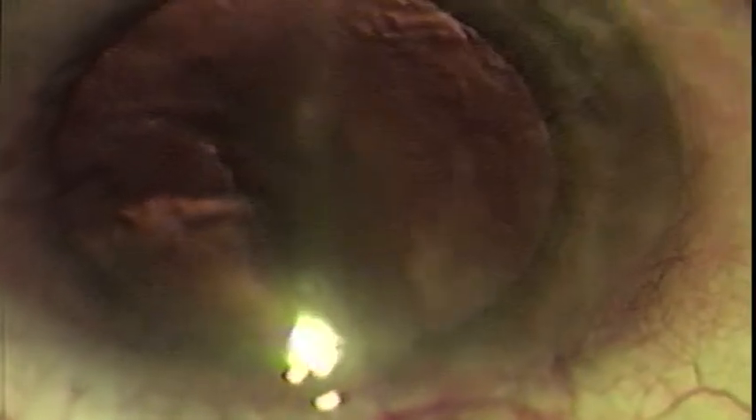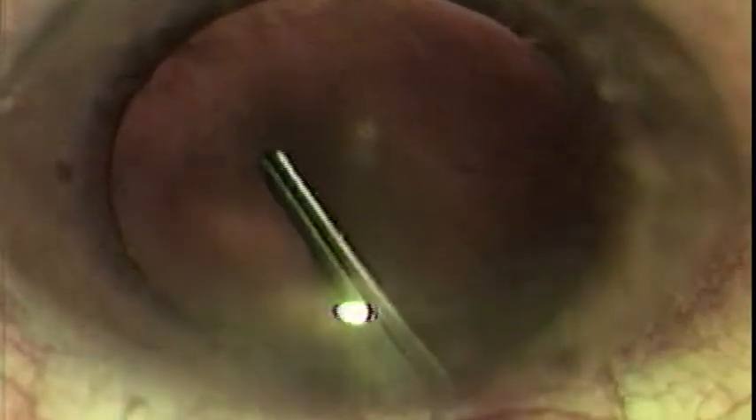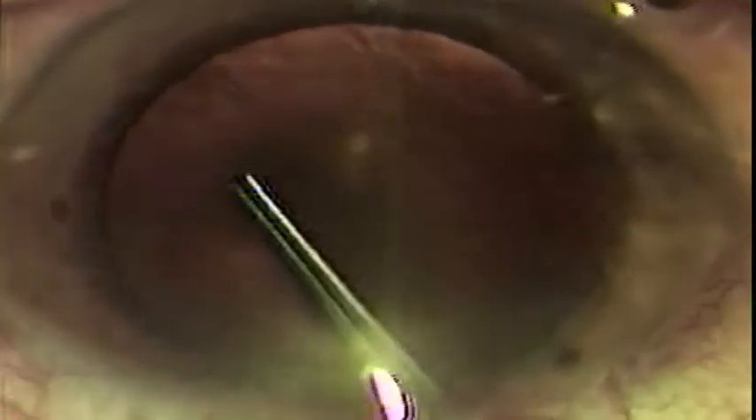The technique usually requires three maneuvers. First, maintenance of the anterior chamber is required with either irrigation or viscoelastic protection. Second, the anterior capsule needs to be opened with a sharp instrument to start the tear. Third, the capsular flap needs to be grasped to direct the tear for 360 degrees in a circular fashion.